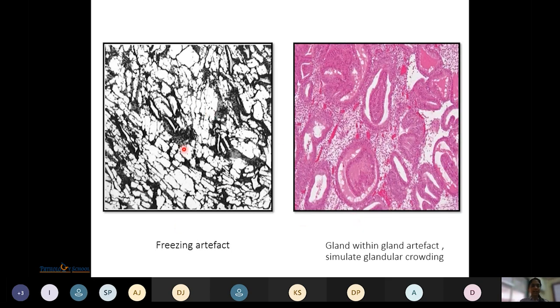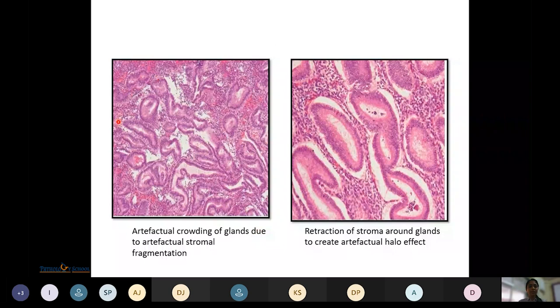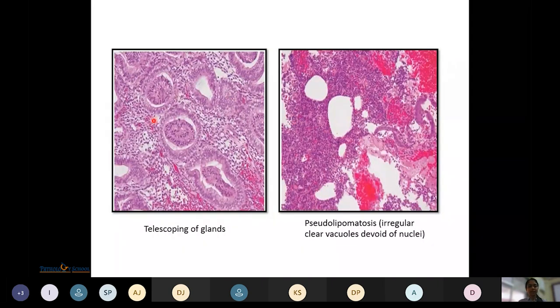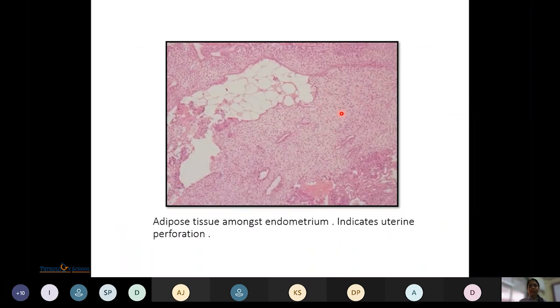Microscopic views demonstrate various artifacts: a freezing artifact, a gland-within-gland artifact simulating glandular crowding, artifactual crowding of glands due to stromal fragmentation, retraction of stroma around glands giving a halo effect, telescoping of glands, and pseudolipomatosis showing clear vacuoles devoid of nuclei. Adipose tissue among endometrium indicates uterine perforation, with lipoleiomyoma as another differential.